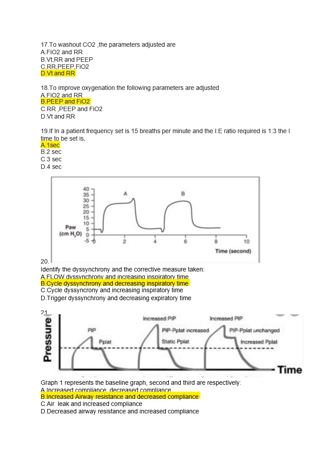But the FiO2 and PEEP are parameters that determine the oxygenation, or the correction of hypoxia. So here the answer is tidal volume and respiratory rate.